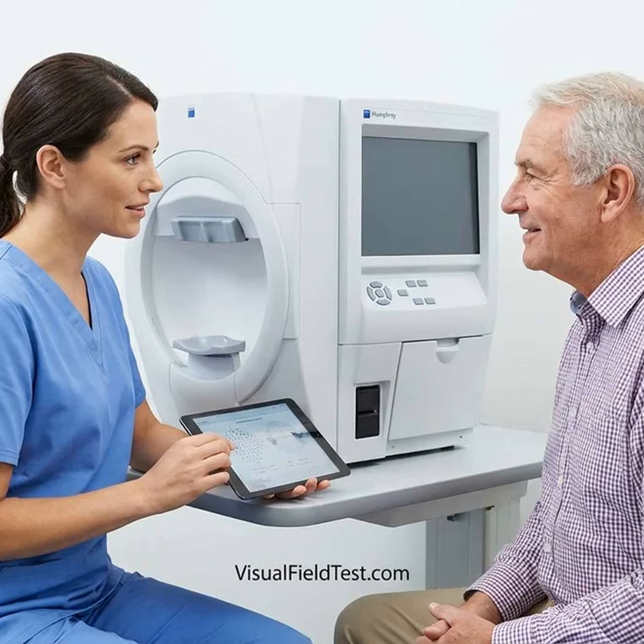Step 2. Show the procedure. Use a video, tablet demonstration, or printed illustration to show the central fixation target, the surrounding flashes, the response button, the covered eye, how the patient should sit, how the technician monitors fixation.